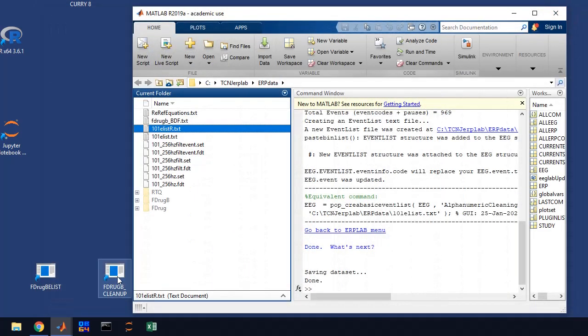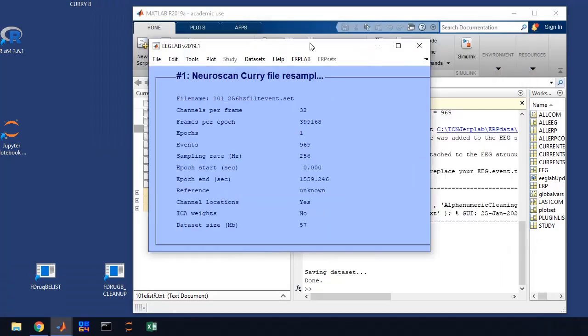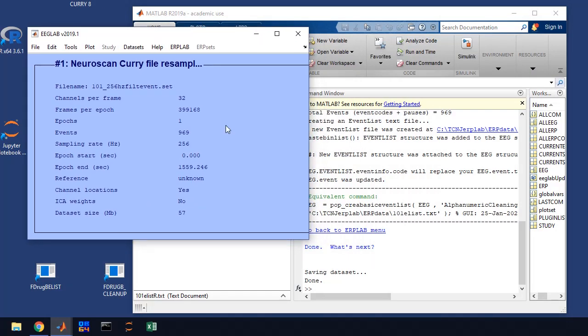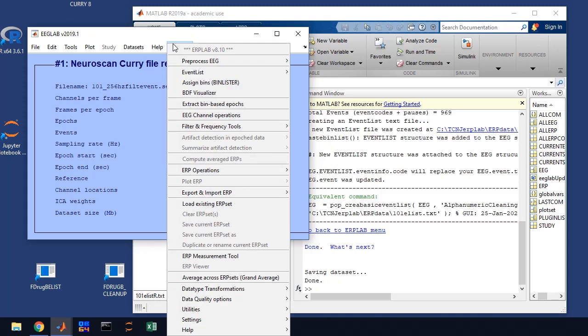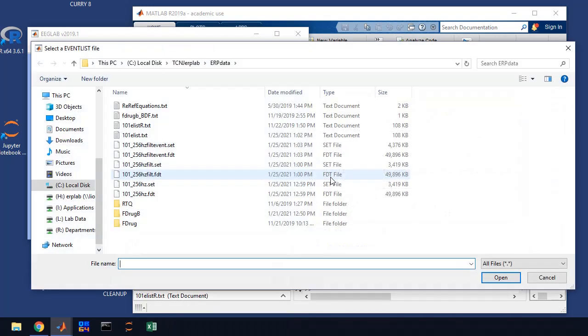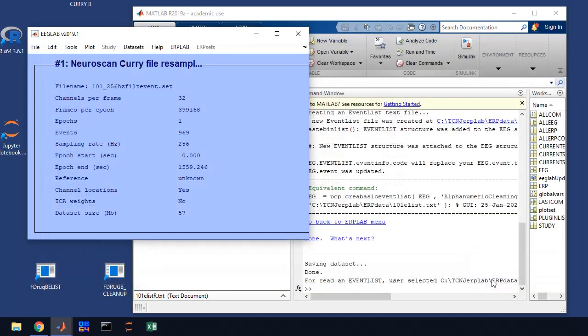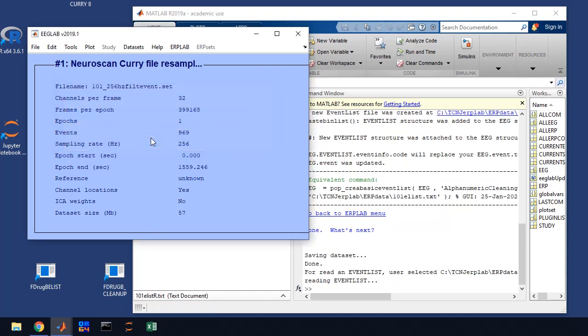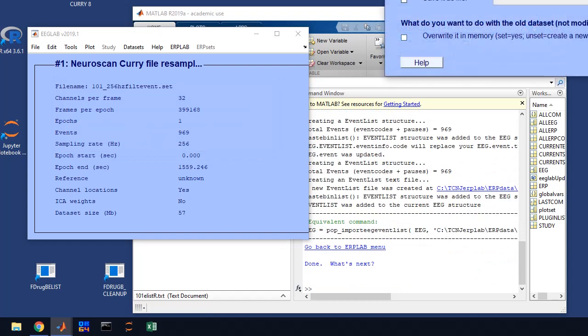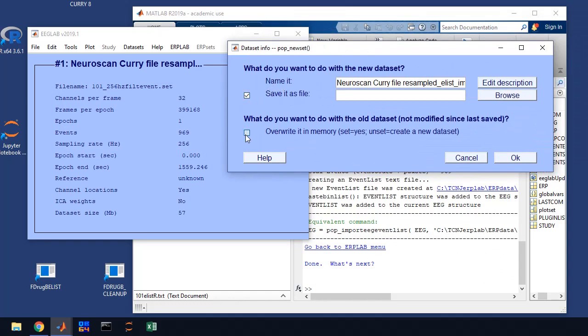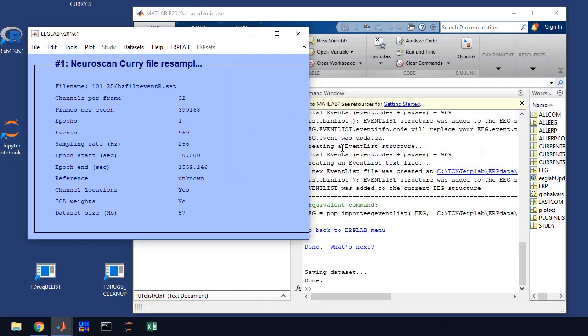Now, what we have to do in EEG Lab, let me bring that window up, is we have to tag that new event list with our EEG data file. So the way we're going to do that is we're going to go into ERP Lab again and we go to event list and we're going to import the event list from a text file. And as you might guess, we're going to select 101 eListR and that's going to tag our new event, recoded event list, into our existing data set. So it's asking you, hey, do you want to replace or overwrite the events? Yes. And the answer is yes, we do. And it's going to ask us to save it. So we're going to save it. And when we save it, we're going to save it with an event R so that we know that it's been recoded at this stage. So we have recoded events in our data file.